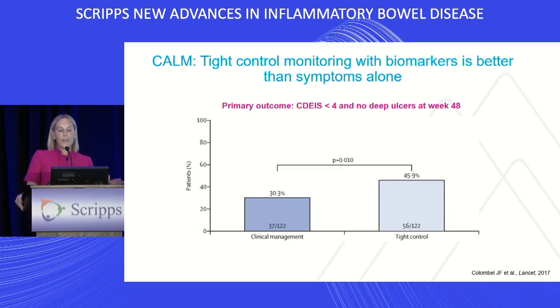And I don't know, Ben, whether you're going to talk about the fact that maybe we need a better biomarker for particularly small bowel Crohn's disease. Remember, 30 to 40% of patients may not even mount a CRP, and Calpro for ileal disease, I'm not so sure is as accurate as colonic, particularly left-sided. So the question is, do we need a better way of monitoring treatment responsiveness imaging-wise? Cynthia already noted MRE being responsive, and whether or not we can take it to the bedside?